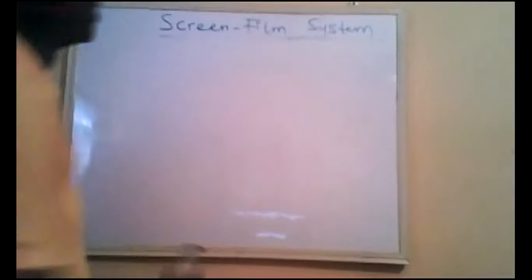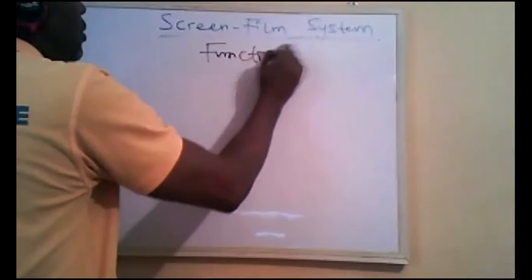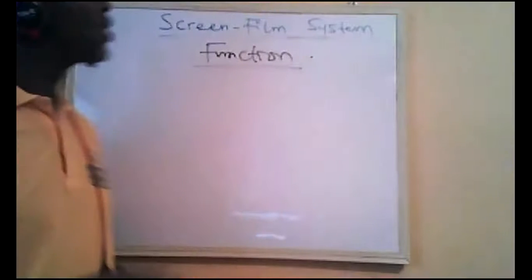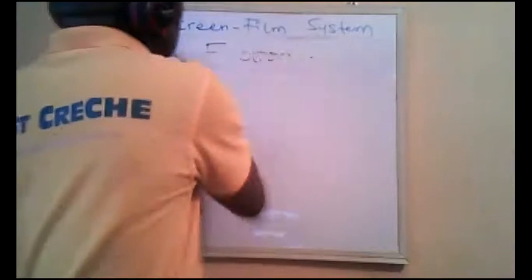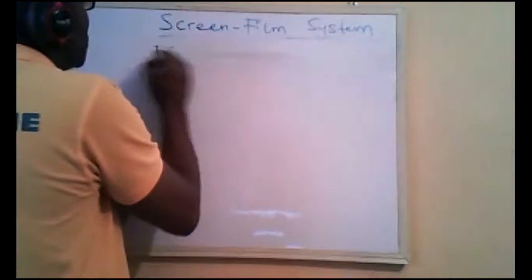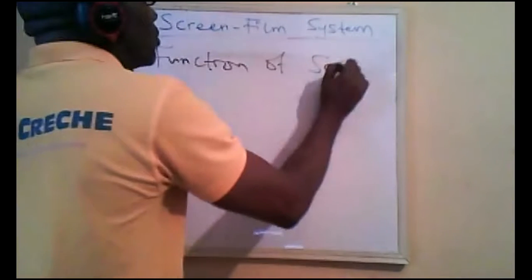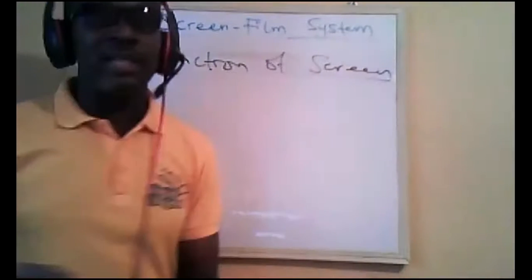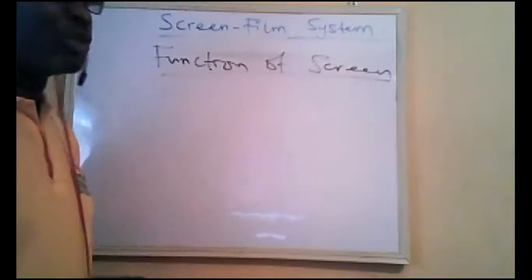We're going to look at the function of the screen. Like we did say in our last lecture, film itself has an excellent resolution, spatial resolution.